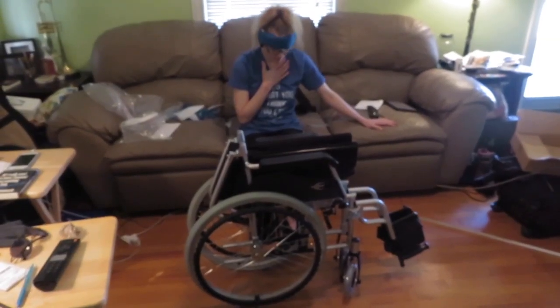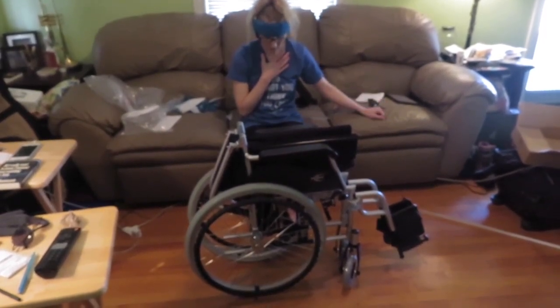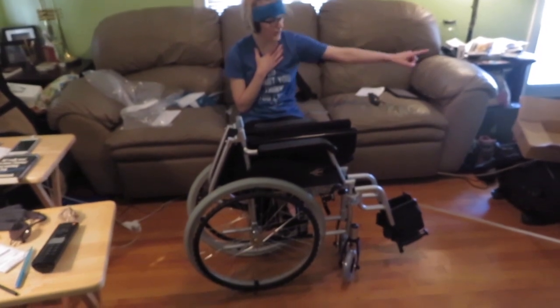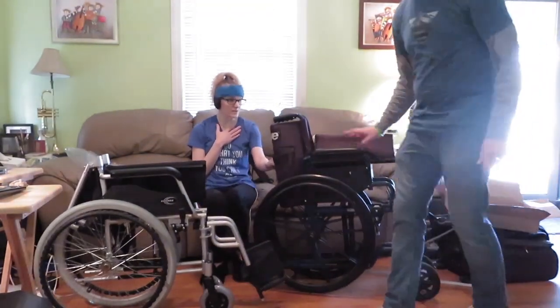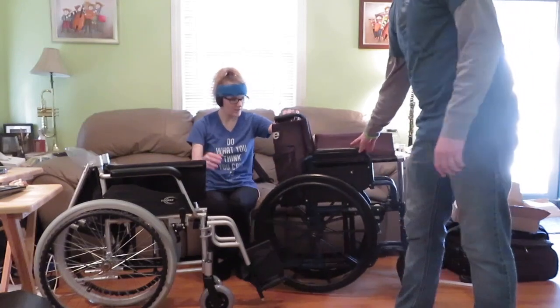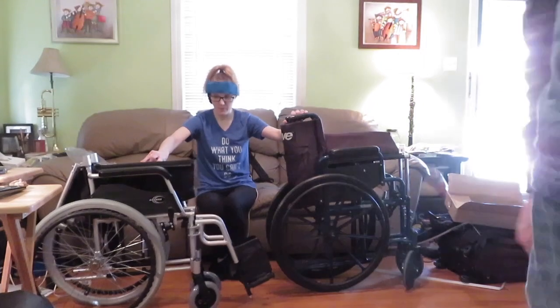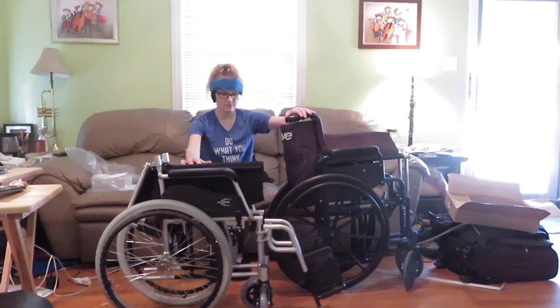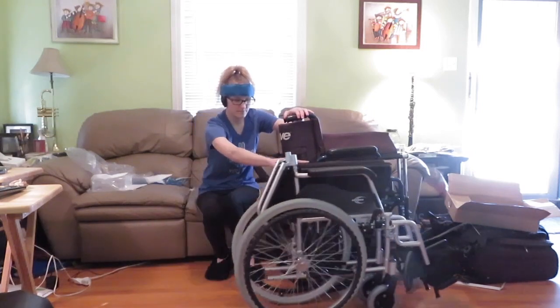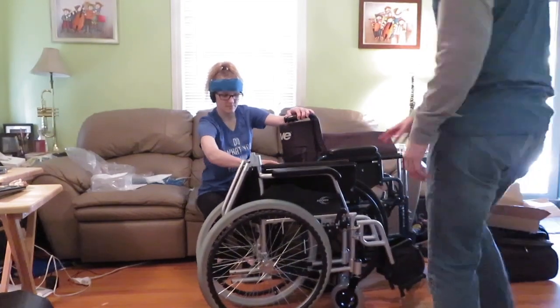If I can pick it up, then any caregiver who needs to assist with this kind of thing can also pick it up. Size comparison here with the feet on — these legs off, it's going to be so much more compact. We felt before that her old wheelchair, the Drive Blue Streak, was pretty compact, but this one with the handles down is noticeably more compact and easy to fit into a car.